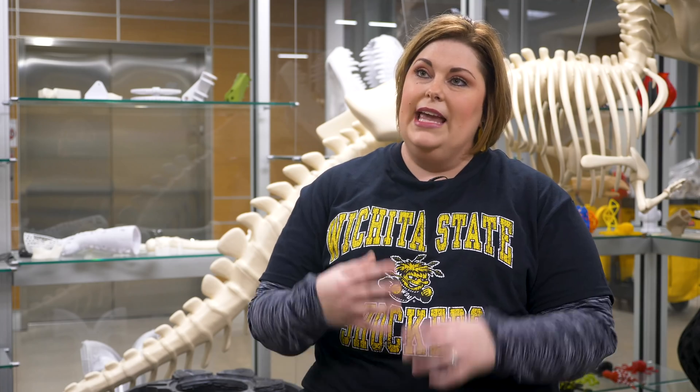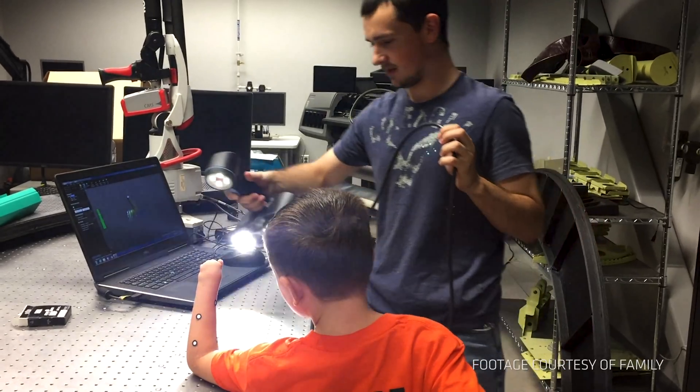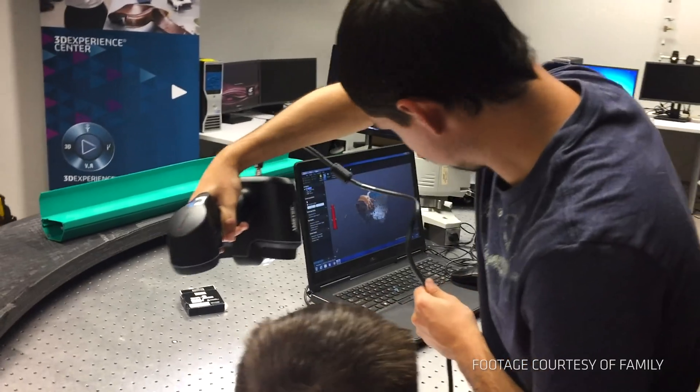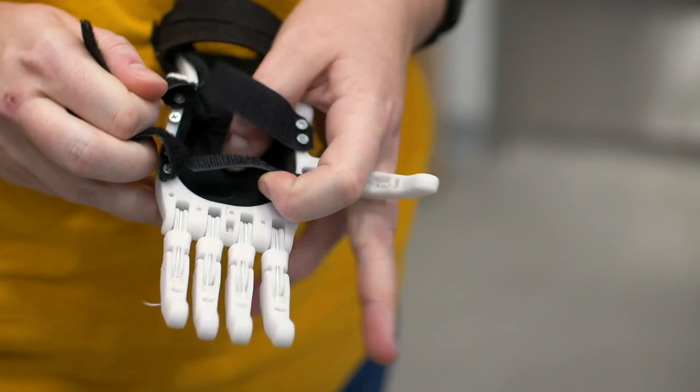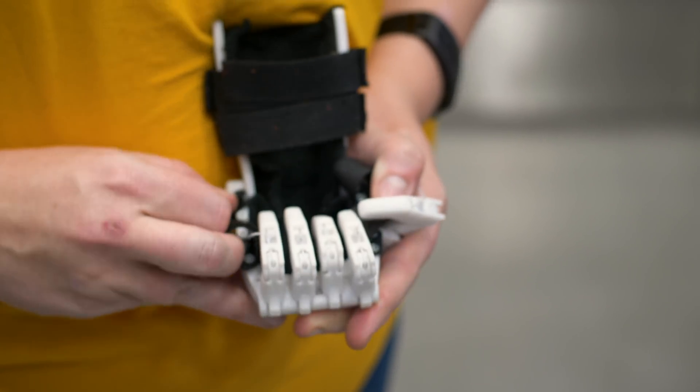We first started off with scanning Chase's little hand. Their ability to scan things in very high detail was very neat to see — they were able to scan Chase's little hand and build the 3D printed hand to match his hand exactly. They also scanned his larger hand so that they could scale the fingers and the hand size so that they were similar to each other.